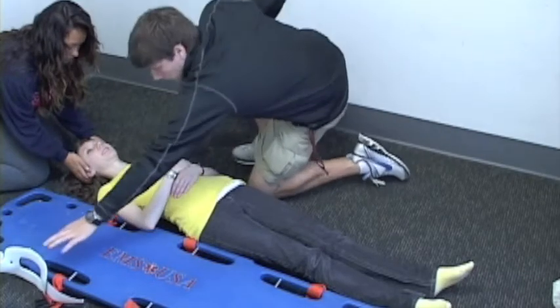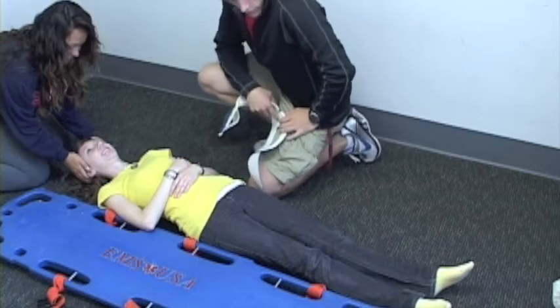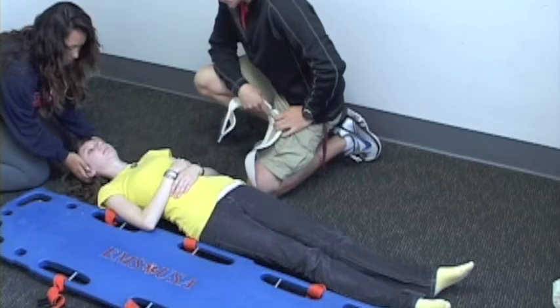Ma'am, how are you doing today? I'm pretty good, except for this lower back injury I have. We're going to put you on a backboard today. We're going to start putting a C-collar on your neck to make sure your neck doesn't move, and then we're going to put you on a board.